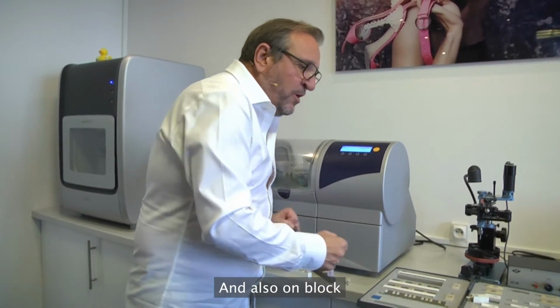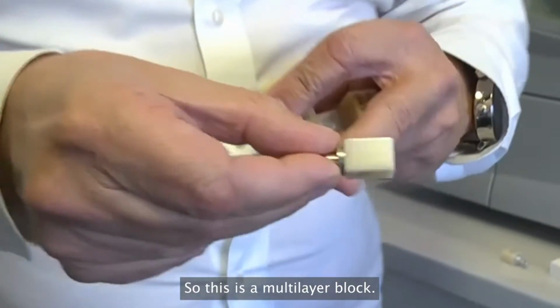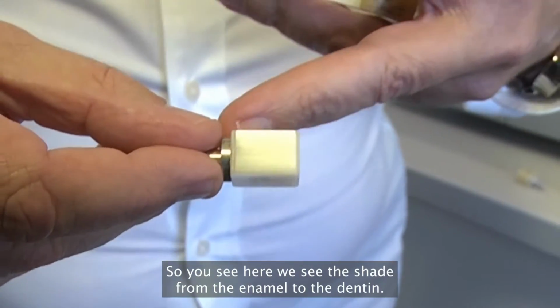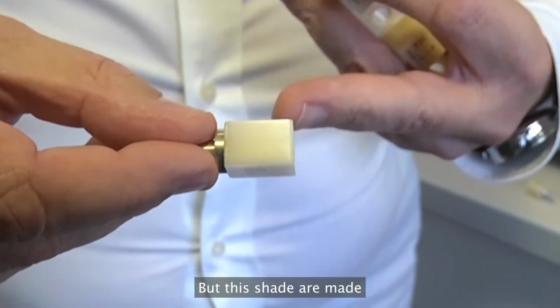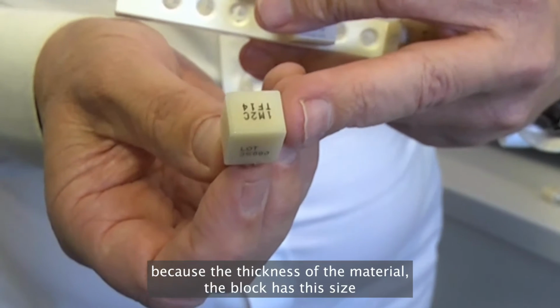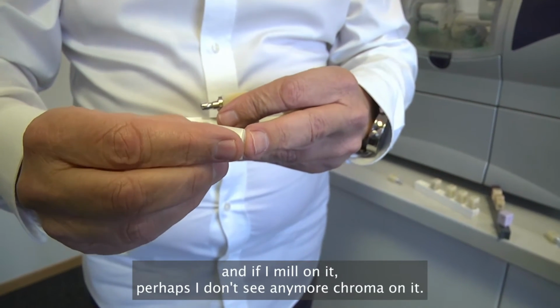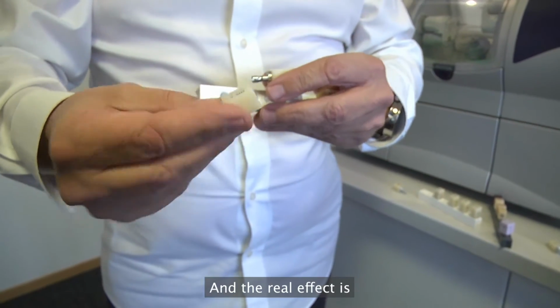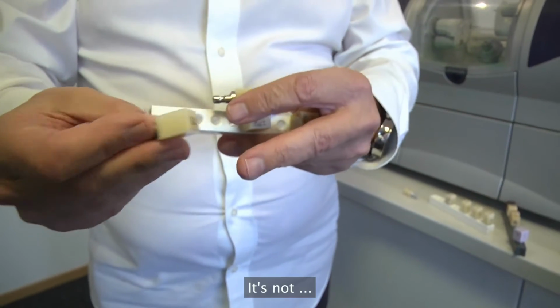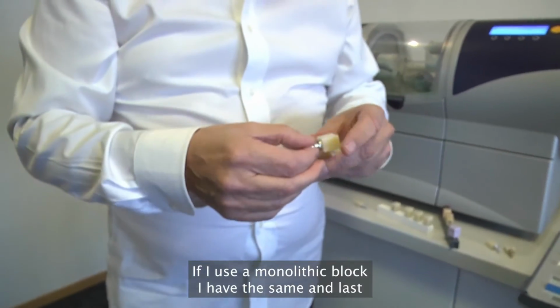And also in blocks, we have the possibility to have a multi-layer block. So this is a multi-layer block. You see here, we see the shade from the enamel to the dentin. But these shades appear because of the thickness of the material, the block, having this size. And if I mill on it, perhaps I don't see any more chroma on it. The real effect is that I don't need multi-layer for that case. There's no sense, in fact. If I use a monolithic block, I have the same.